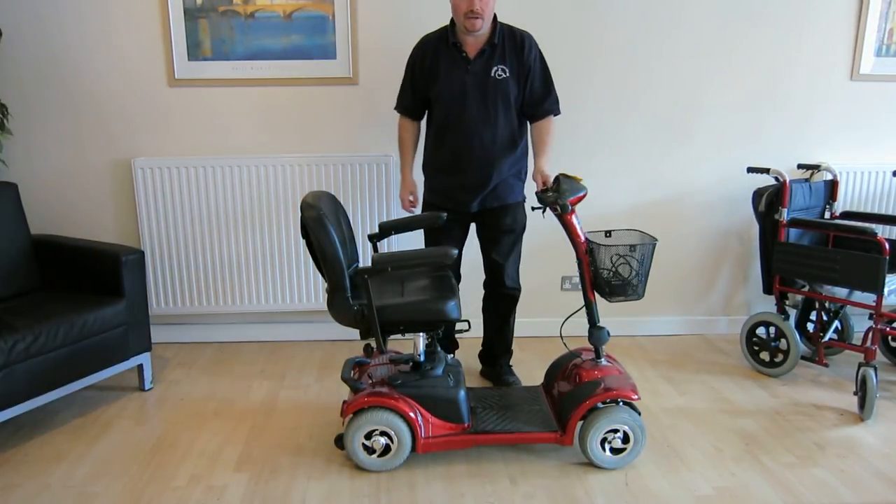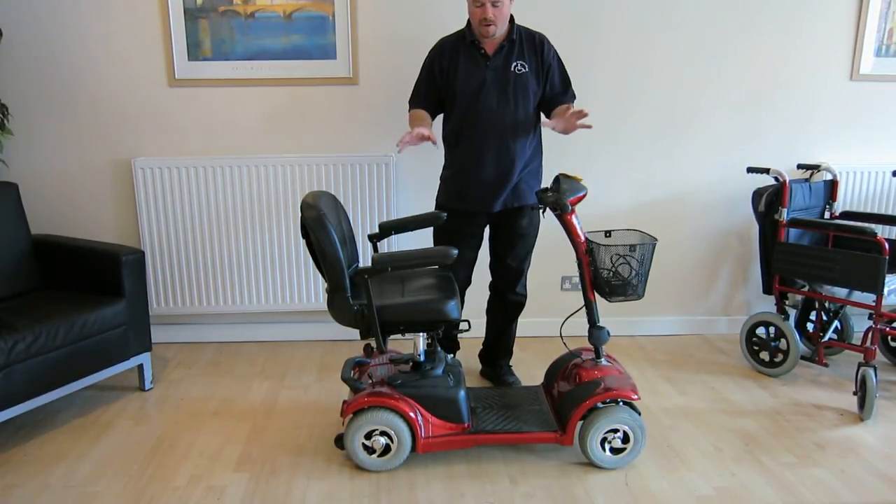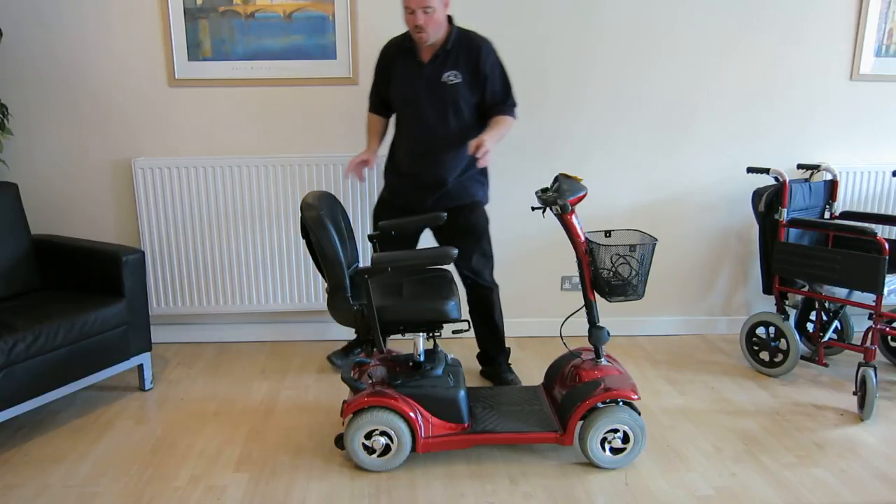Hi there, this is a quick video about how to break apart this mobility scooter called the Explorer 4.